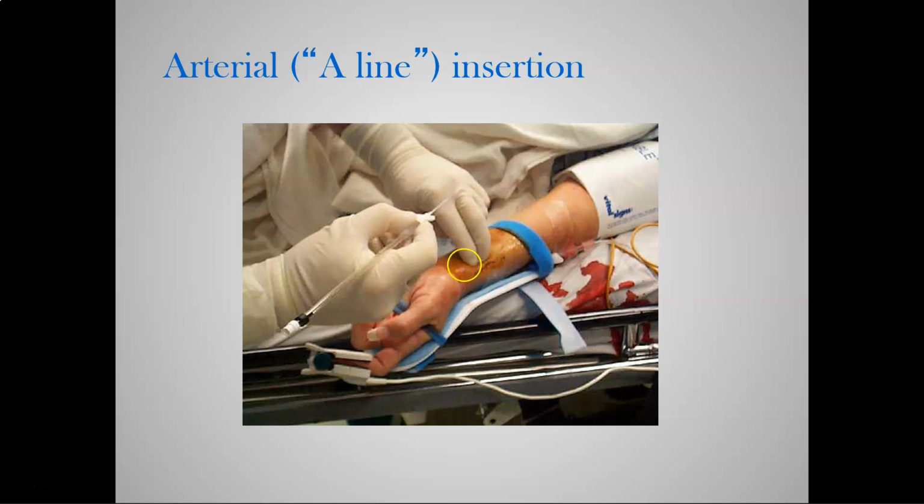They're going to find them, okay? All right, found them. And typically they're going to find them with not just pulsatile sensation. A lot of people use ultrasound now. In fact, ultrasound is the gold standard in how the intervention is taught. So once they locate the artery, they mark it, they feel for it, and boom, we insert the bevel, the tip of the catheter. We find it, we get flash, and then it's just like an IV, but for an artery.